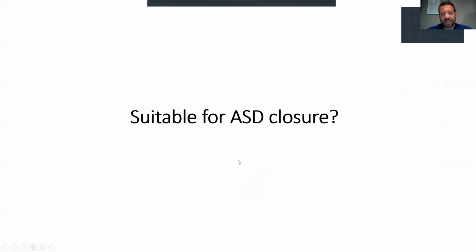So let's see some cases, if they are suitable for ASD closure or not. And then we will go through 2 cases that performed a transcatheter occlusion.